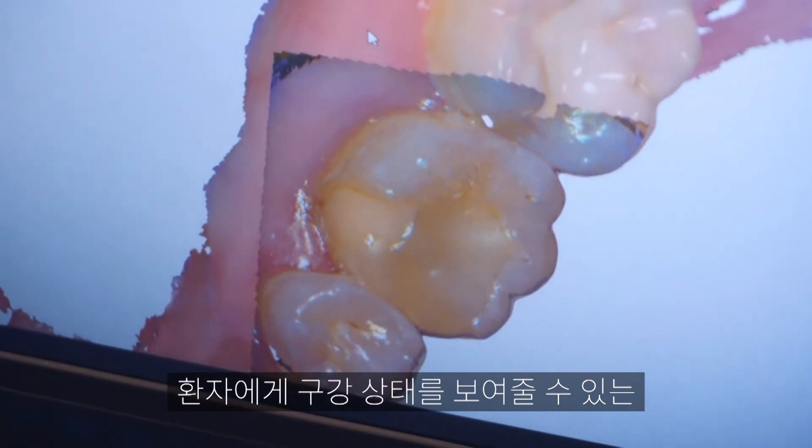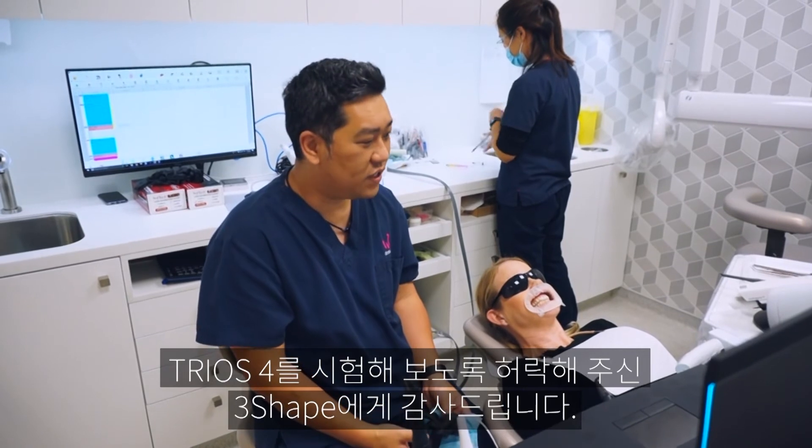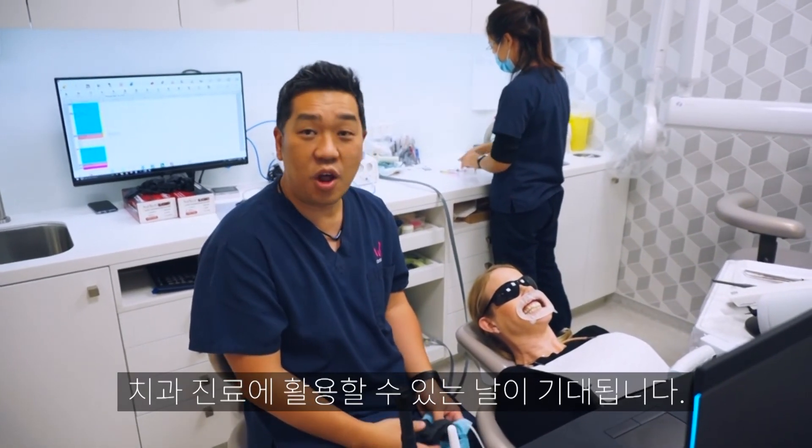This is a really good diagnostic aid — you can show patients this. It seems like a really good tool. Three Shape, thank you for letting me test drive this new Trios 4; I'm really looking forward to having one in my own hands and applying it in my clinical practice.